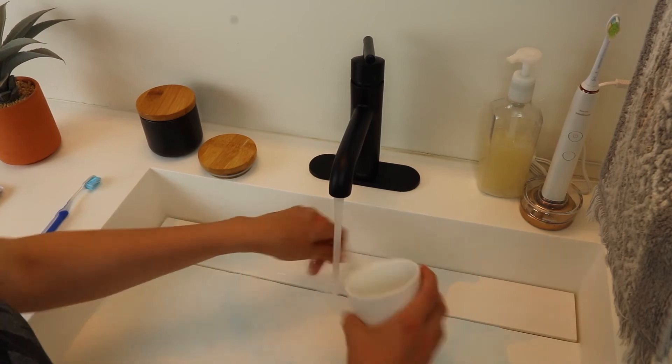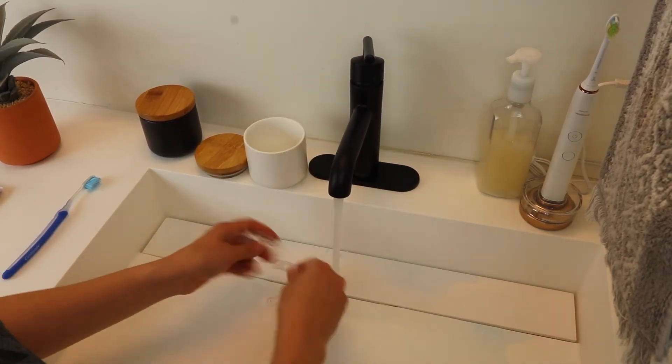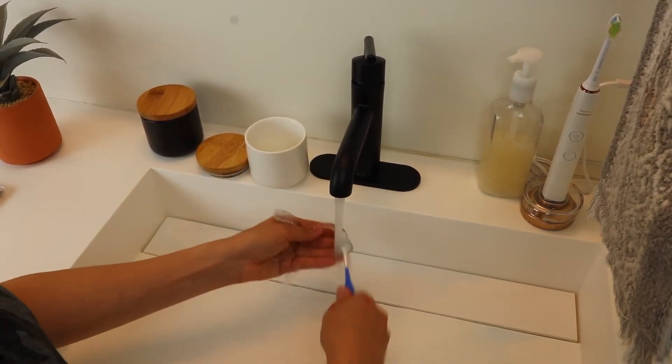Once I brushed my teeth and was ready to put the aligners back in, I would take them out of the solution, dump the solution, and then brush them under cool water with a designated toothbrush. I found that using my Sonicare toothbrush to do this was just a waste because the bristles get damaged and those Sonicare toothbrush heads can be pricey.